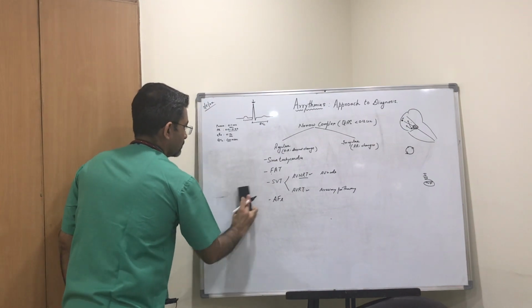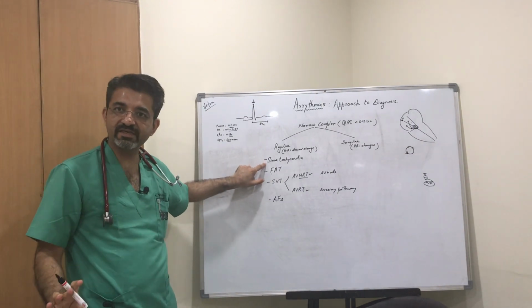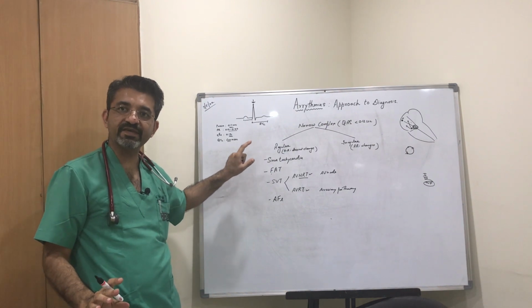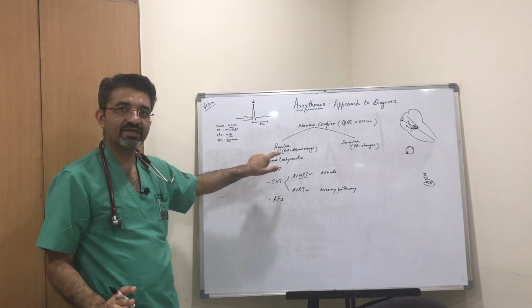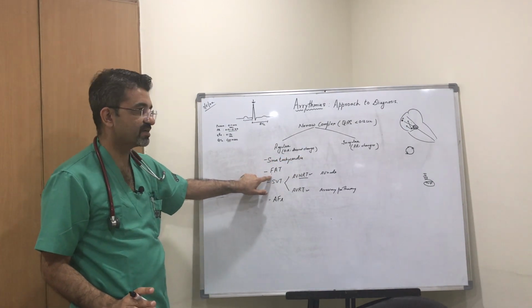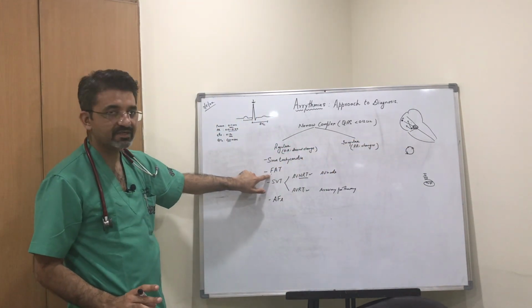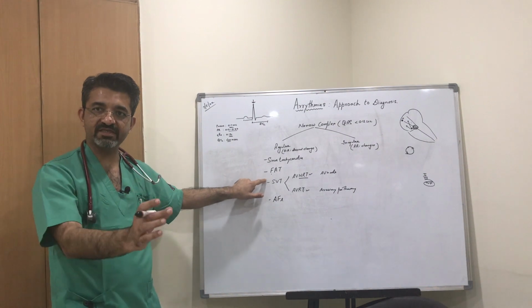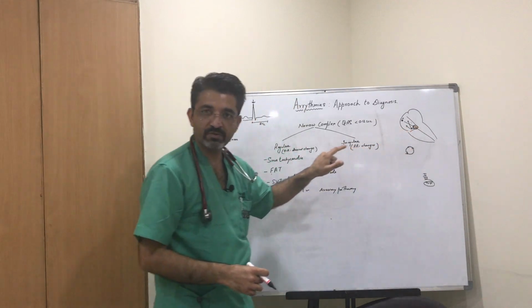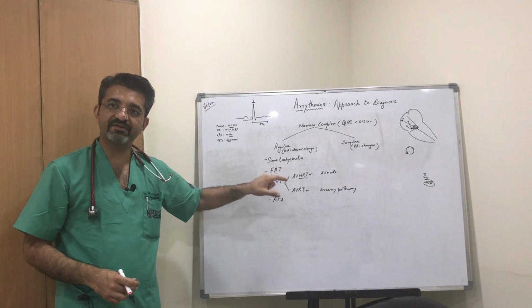Follow now sinus tachycardia, that you have upright P waves in 2, 3, aVF, negative P wave in aVR. Every P wave is followed by QRST. This is sinus tachycardia. Rate is less than 150. Focal atrial tachycardia, there is a single focus elsewhere than the SA node. It is negative in 2, 3, aVF, followed by QRST. PR interval may be shortened because this ectopic node will be nearer to the AV node. Then you have SVT, wherein P wave finding will be very difficult.